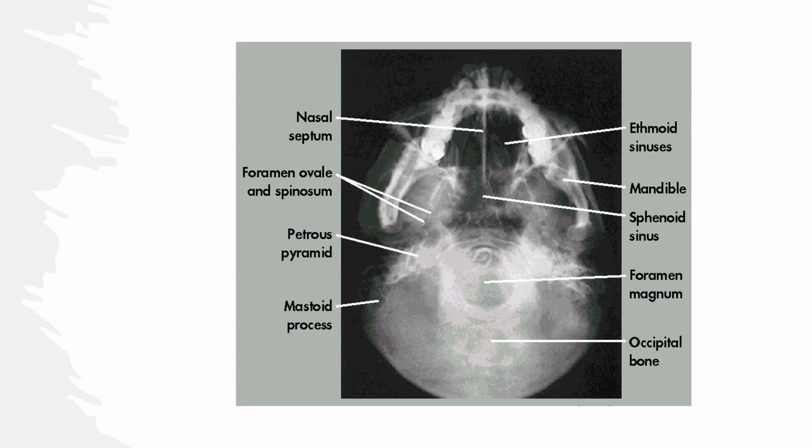Your 80-year-old patient is not going to get into the optimum position. Some of your 40-year-old patients won't be able to get into this position. Okay. There's a cheat for it though. So I'm going to teach you the cheat when I show you the radiographic position on the next slide.